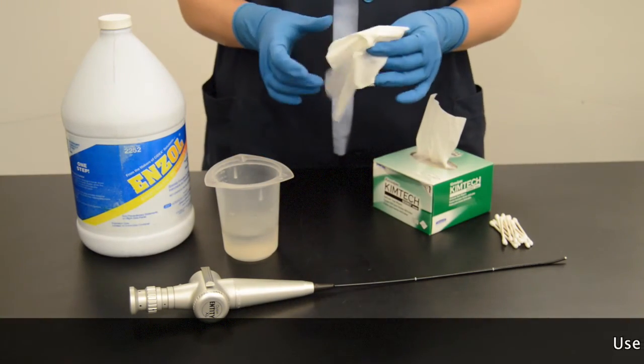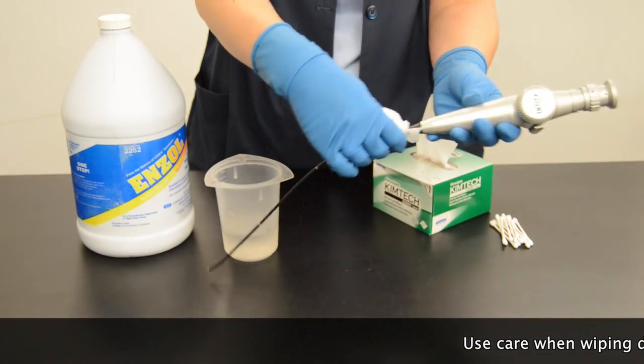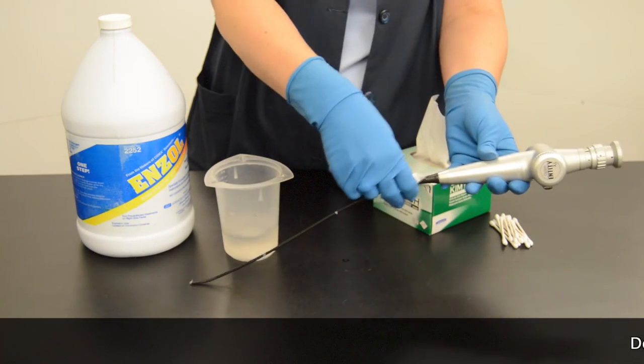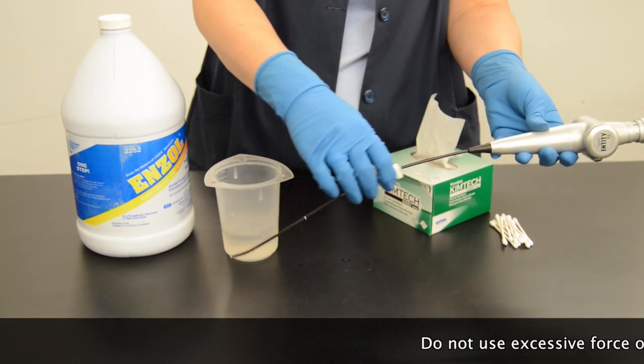Optum recommends the endoscope be pre-cleaned immediately after every patient procedure. This will prevent patient material from adhering to the endoscope. Dried material is difficult to remove and can render the disinfection or sterilization process ineffective.